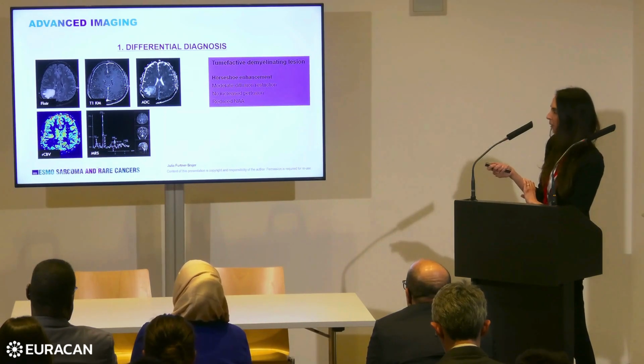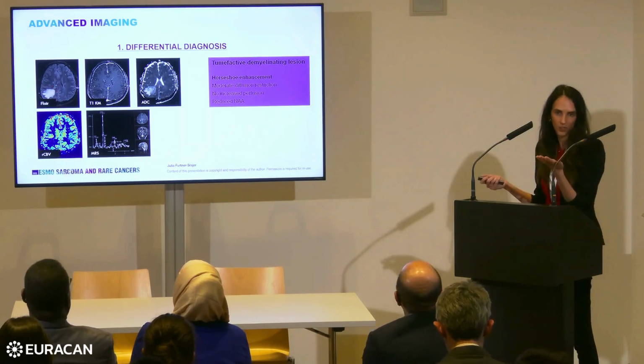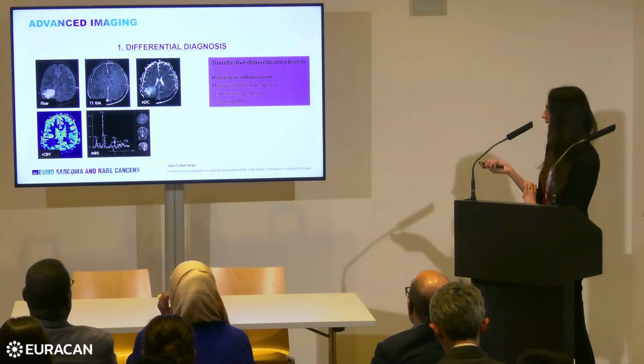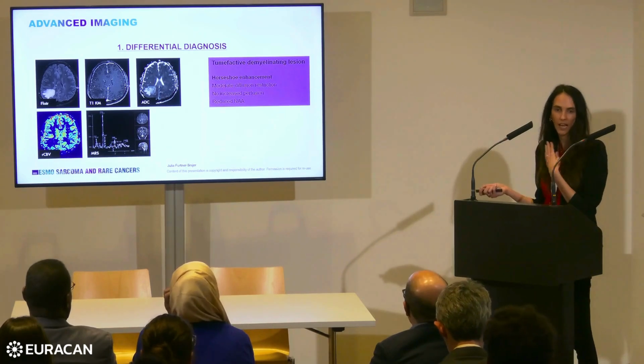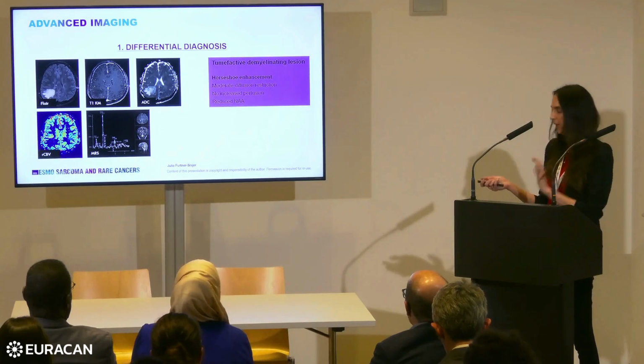What can also help you here is that you can see small, tiny hyperintense dots, which are MS plaques, but they don't have to be there in any case. So I think these cases are very tricky, and I would go for further imaging just to include other differential diagnoses.